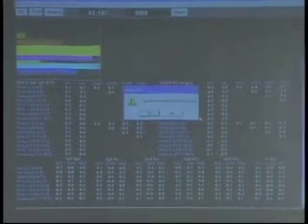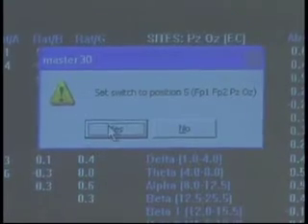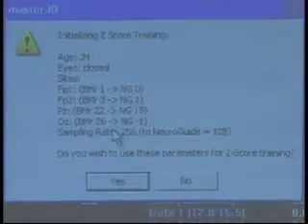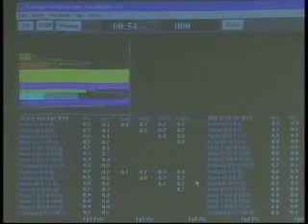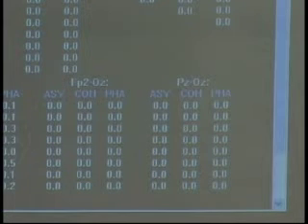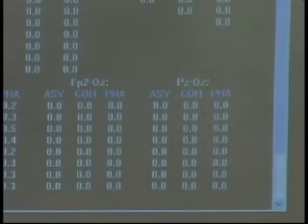Position 5 — you'll have FP1, FP2, PZ, and OZ. OZ is an open channel right now. I'll assume we're getting clean signals. You'll notice that Z scores do not compute for OZ, which is appropriate because OZ is not a 10-20 location. Aside from that, everything's normal.